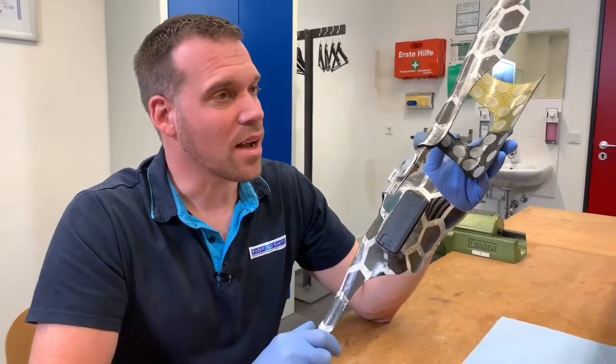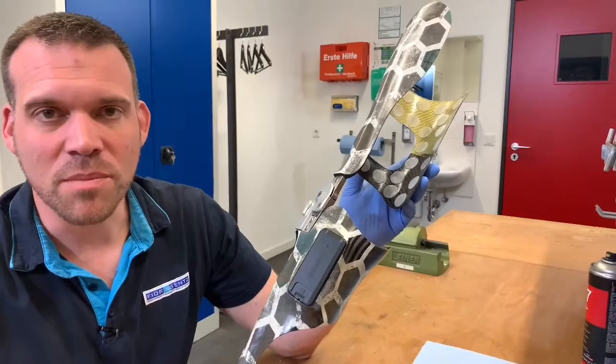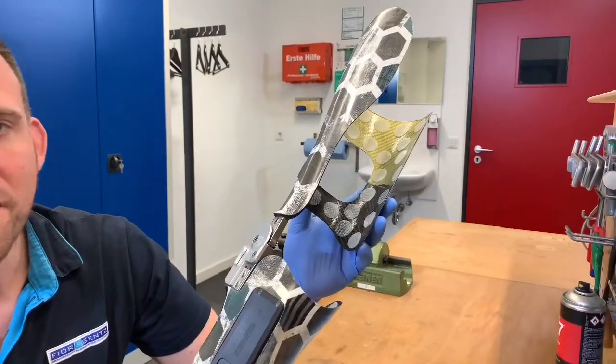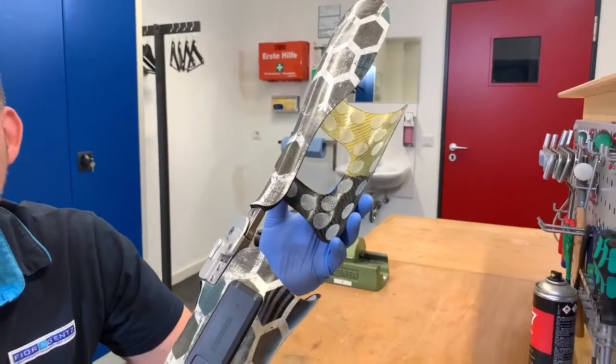Let's say we need to do the maintenance on a neurotronic KFO in the workshop. I first removed the X-Dry inner padding material, and as you know, this can be washed and replaced if necessary. This is not only hygienic, but it is also the best way to check the laminate for damage.